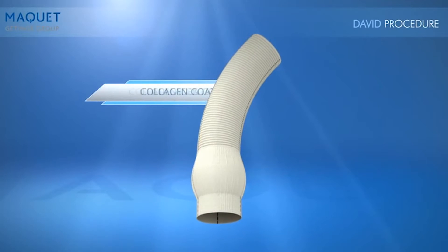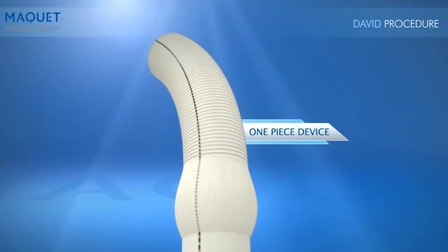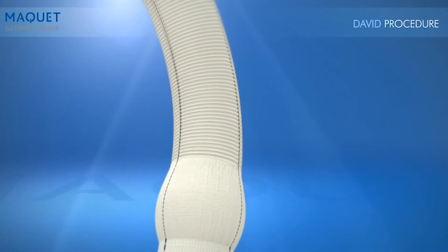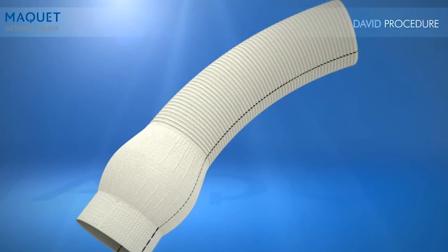The Maquet Cardioroot is a collagen-coated, one-piece device designed to repair or replace the ascending aorta. The Cardioroot graft features three distinct sections in one piece, unlike other grafts that are three pieces sewn together.